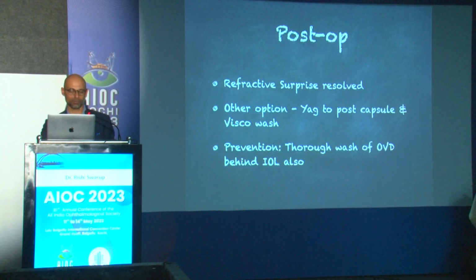Otherwise, one could go and wash the IOL, or one could even do a posterior capsulotomy, but it's not ideal in the initial postoperative period. Of course, prevention is better than cure.